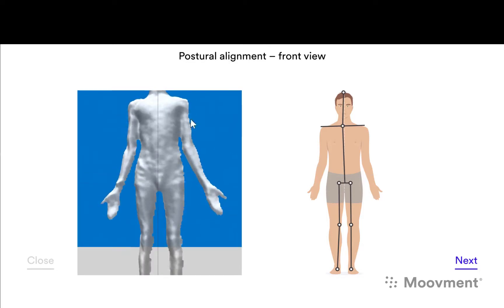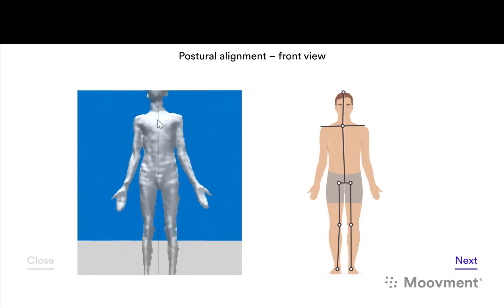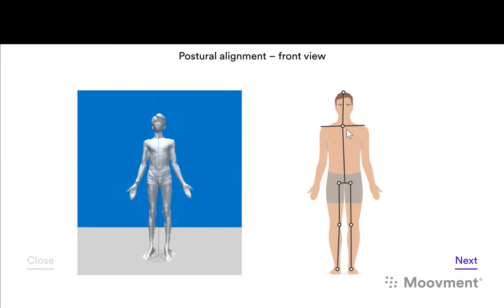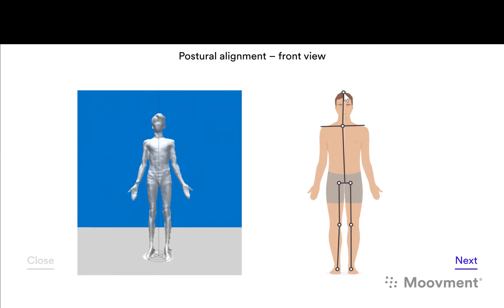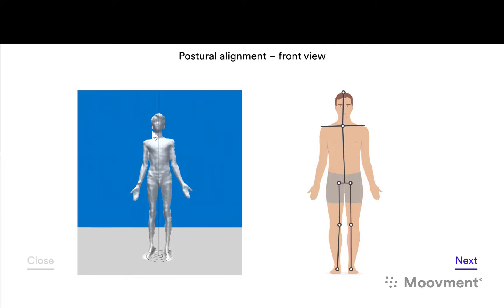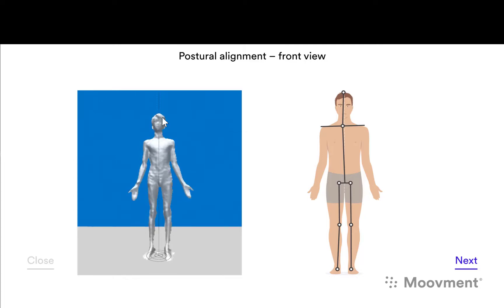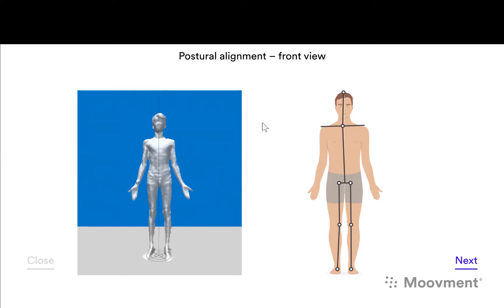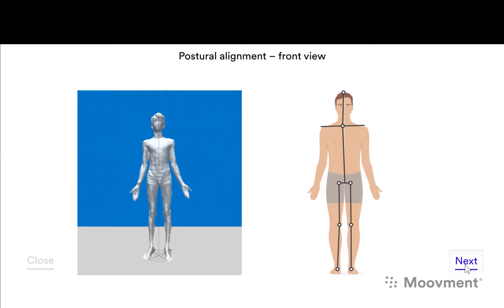You can also see that the trunk is a little bit deviated across to the right, and yet the head is centered, which means that the trunk and the neck moving to the right side is matched by a lateral tilt side tilt to the left of the head, and that means the top of the head is sitting in the middle.